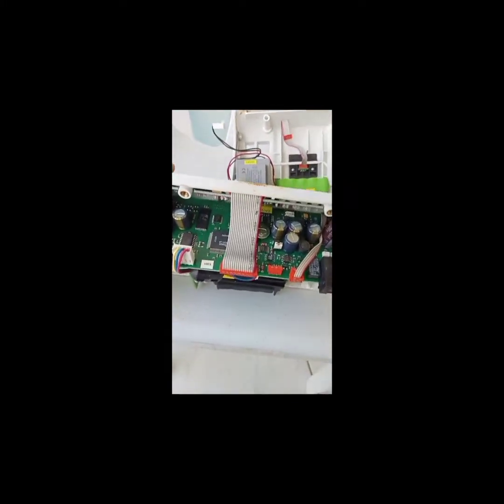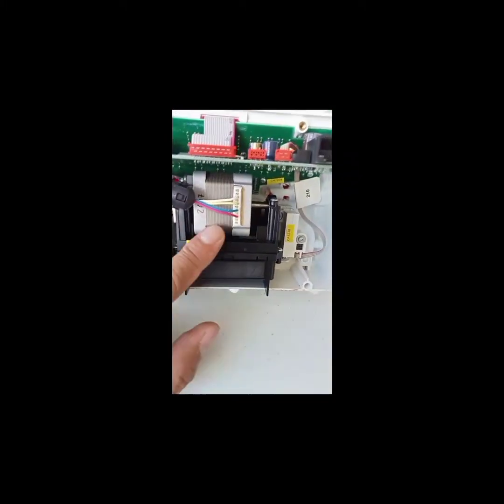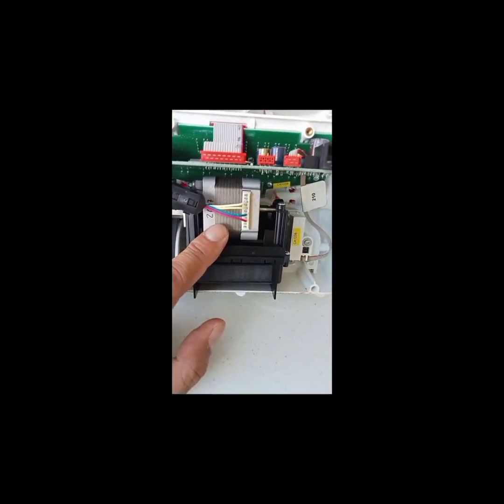Okay, as you can see upside, we have the main board, and we have here the mechanical side. This is the stepper motor, and we have the belt and the reduced gear. We have the big one and the small one connected to the motor.